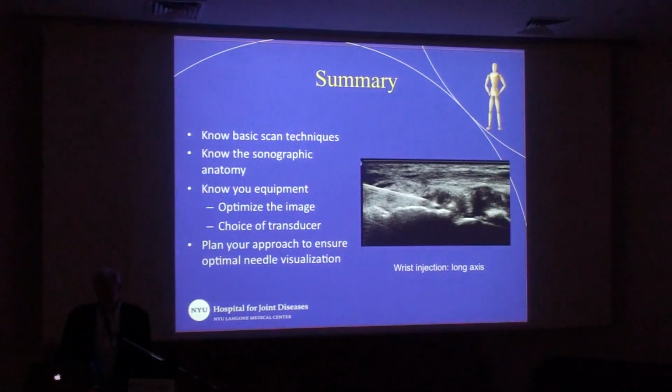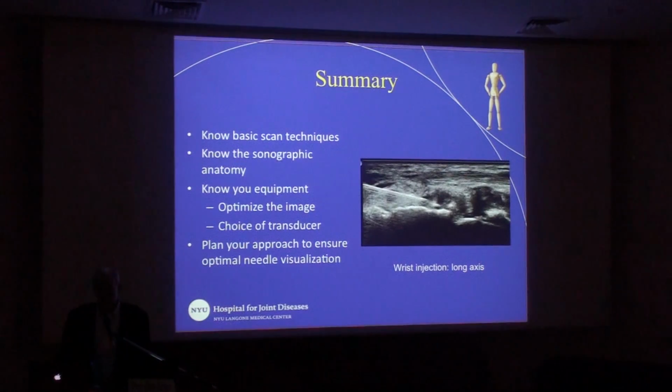So in summary, hopefully I've given you a fairly extensive overview of what ultrasound's capable of. The important things are to be familiar with scan techniques, know your ultrasound anatomy, and then know how to optimize your images, and I think you'll have a very successful time doing these types of procedures.